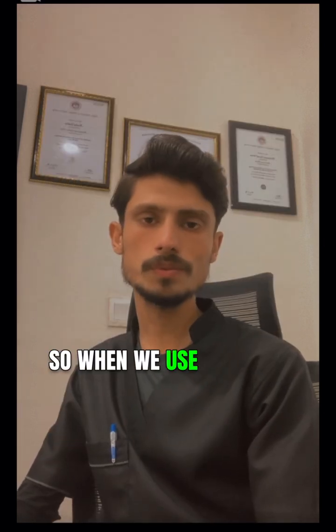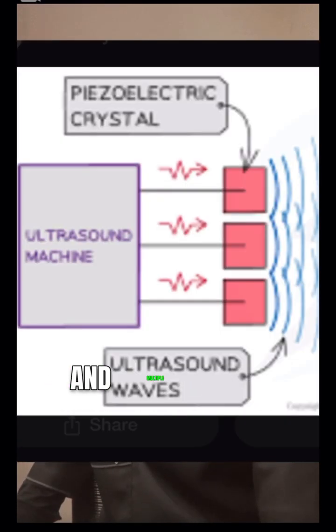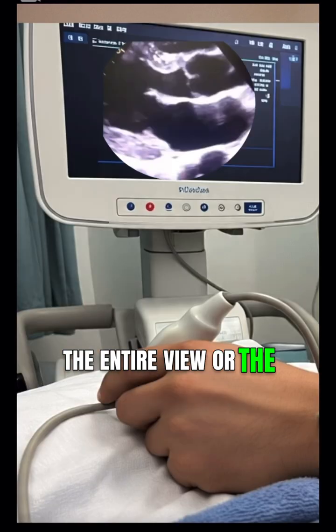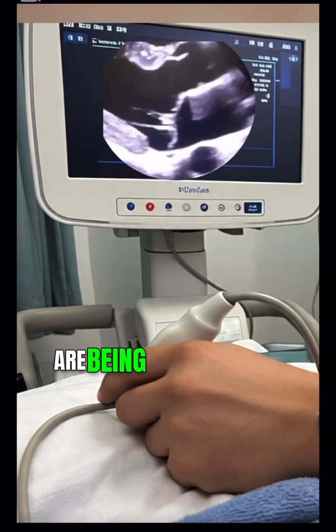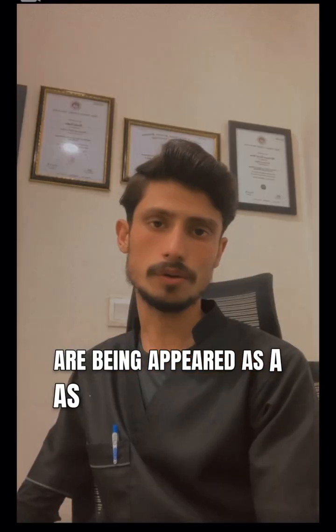When we use multiple piezoelectric crystals and multiple waves, the entire view or structure of the heart appears as a whole on the screen.